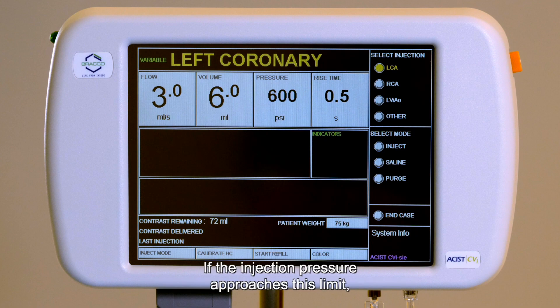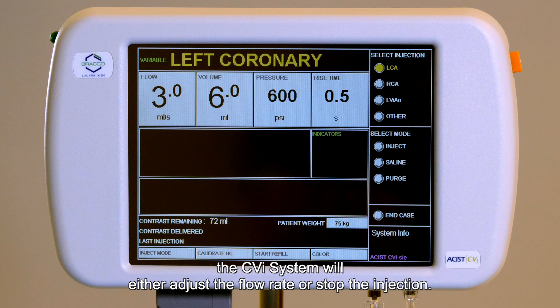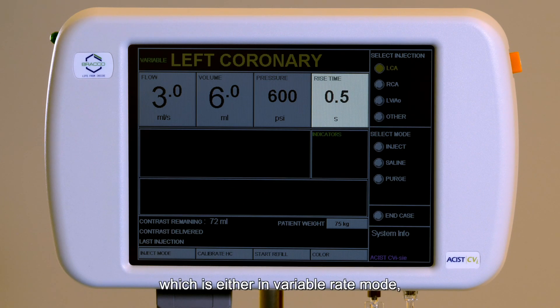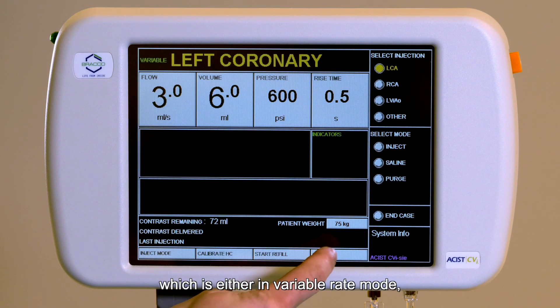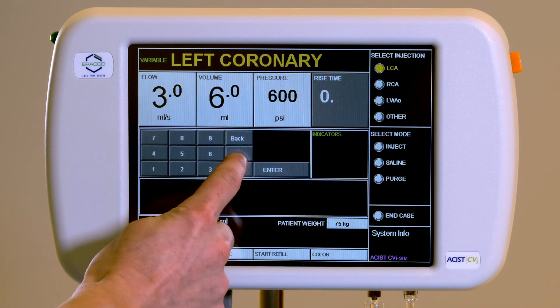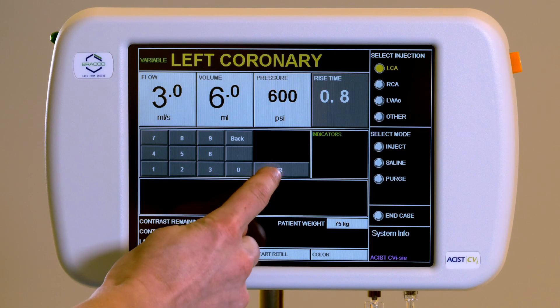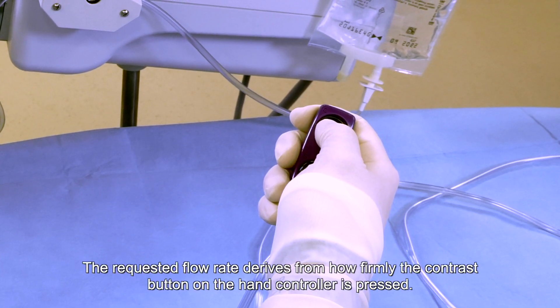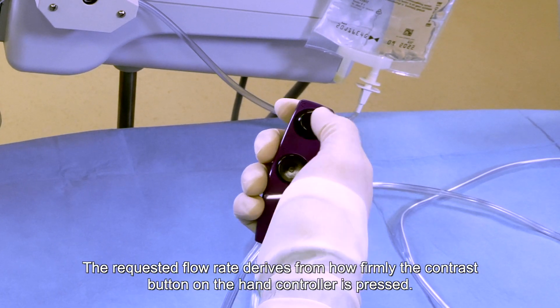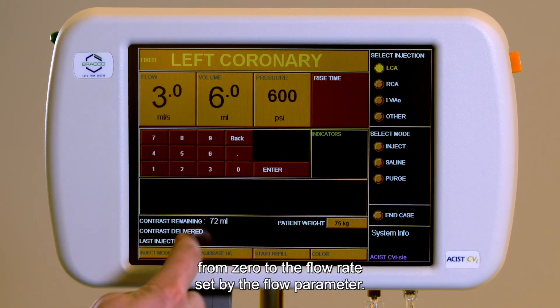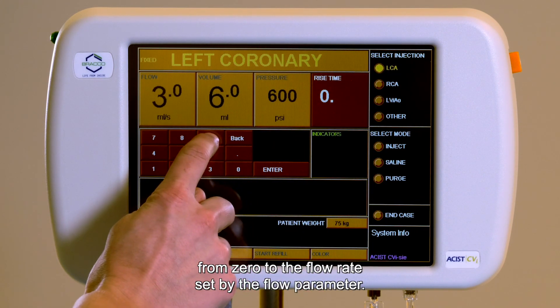If the injection pressure approaches the limit, the CVI system will either adjust the flow rate or stop the injection. Rise time: this allows the user to set the rise time, which is either in variable rate mode the time it takes the system to go from zero flow to the requested flow rate — determined by how firmly the contrast button on the hand controller is pressed — or in fixed rates mode, the amount of time it takes the system to go from zero to the flow rate set by the flow parameter.